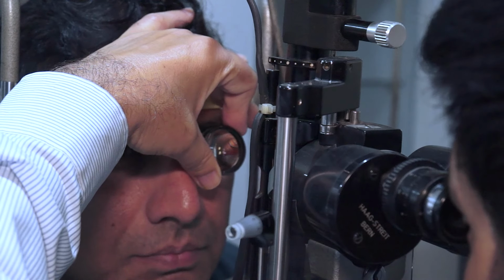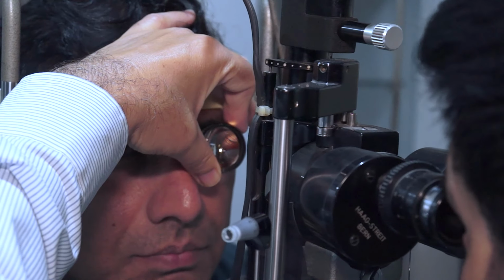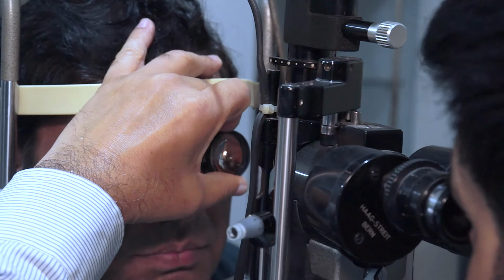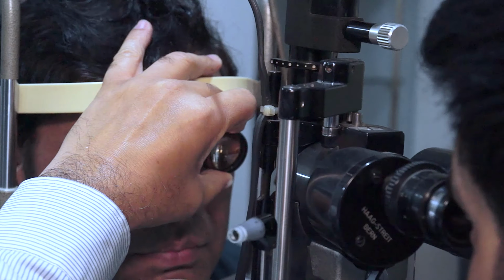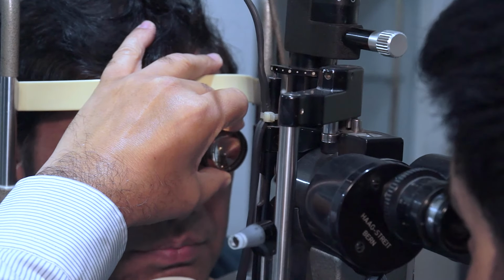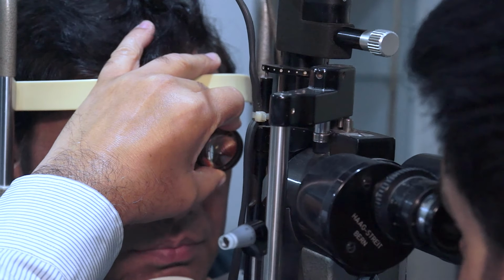You can check the inferior retina when the patient is looking up. You can check the superior retina when the patient is looking down, but you have to bring the machine down there. So it is opposite that you have to examine with this slit lamp and this lens.